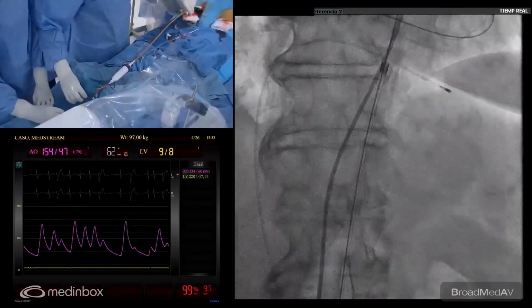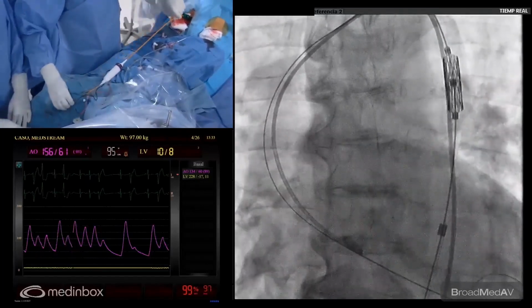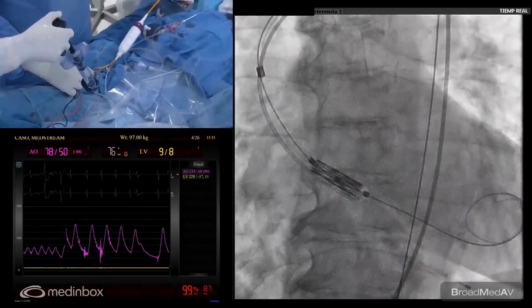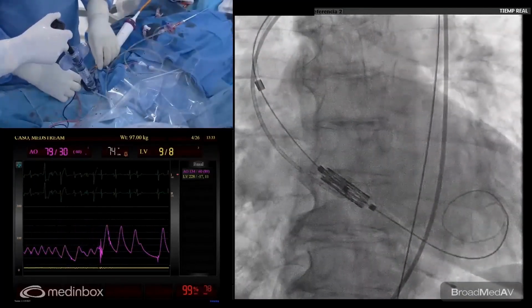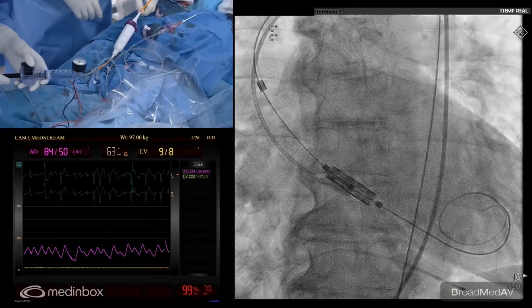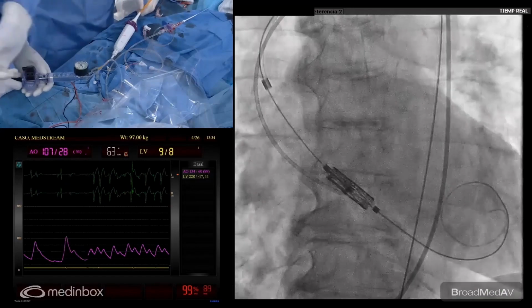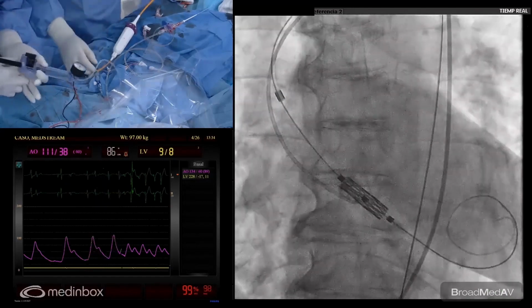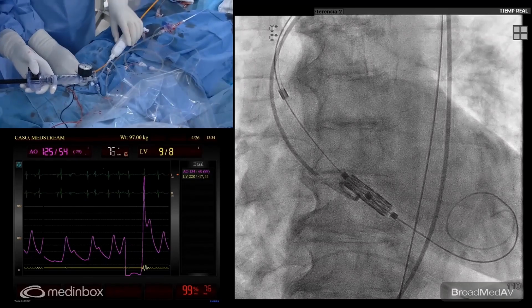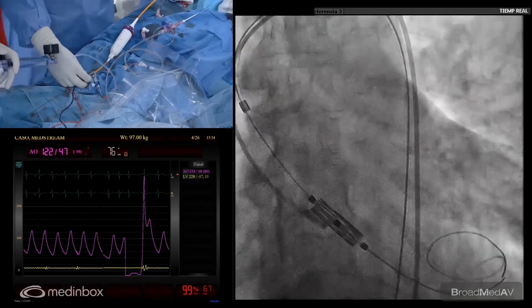50%. Show me up. So at this point we deflect 50%. Now we are deflecting. Almost in. Great, great. Let's zoom. Yes, careful. So now we will pay attention to the position. Go to the working projection, oblique to the right. We'll always go to the working projection, which here is the cusp overlap.